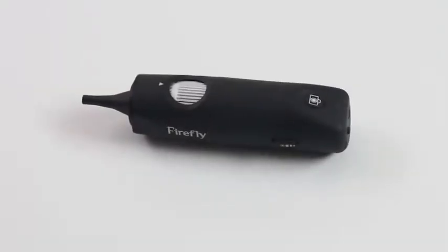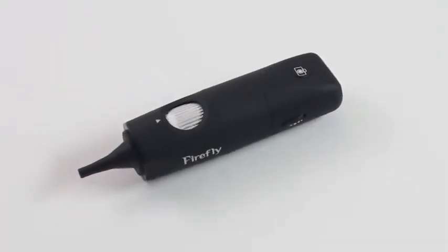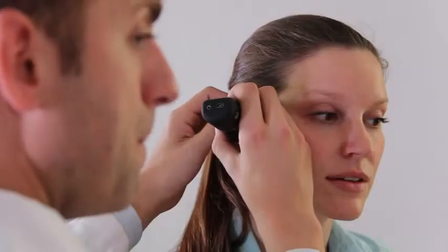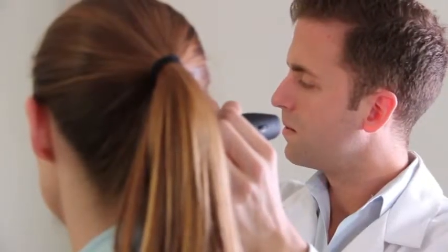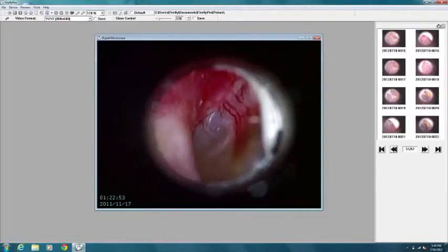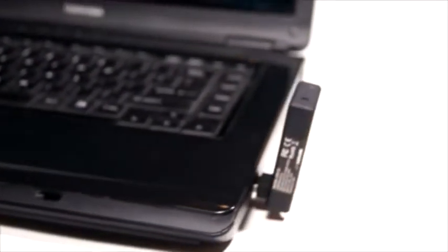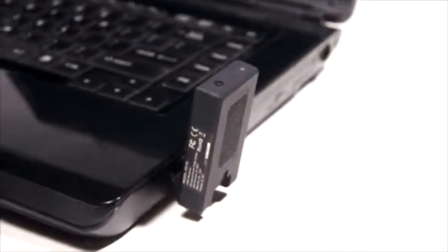Introducing the Firefly DE550, a wireless video otoscope at a revolutionary price. The DE550 is easy to use. It wirelessly transmits 30 frames per second video to your computer in real time, where video and still images can be captured using the Firefly Pro software. Wireless transmission occurs on a proprietary connection, reducing the risk of interference with Bluetooth or other common wireless technologies.